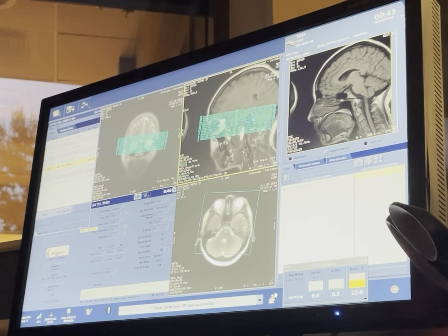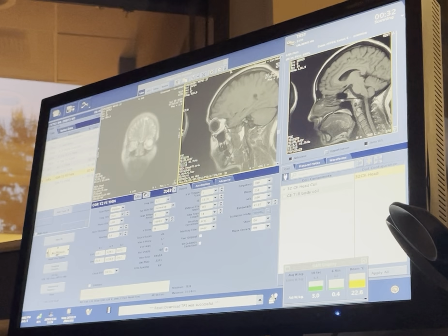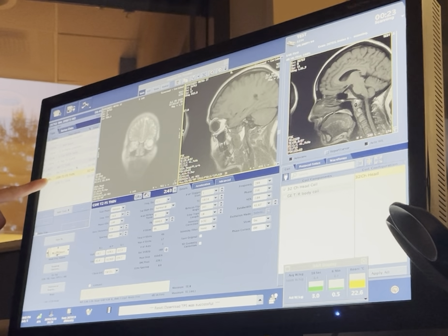Okay, so now let's go into the coronal. So I did that without the auto scan? You clicked save and scan. Right. But she was asking about the next one, the link. For this one, it links by itself. Auto scan is just, it's gonna scan the next one for you, since it's already saved, it's planned and saved. RX means it's saved. And they're linked. It'll automatically scan it if this is on. If this is not on, it'll just sit there. Nothing will happen. So I should press scan for this one too? Yeah. So don't worry about it.